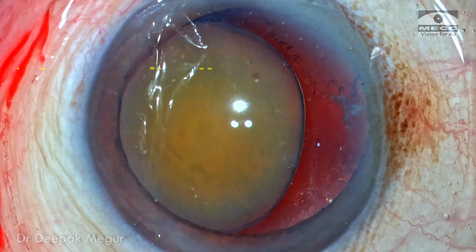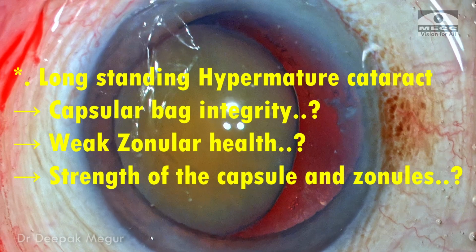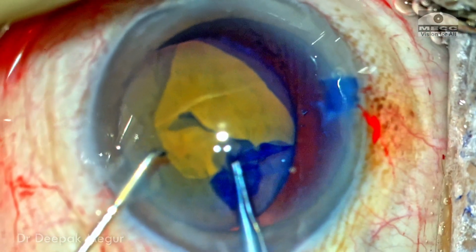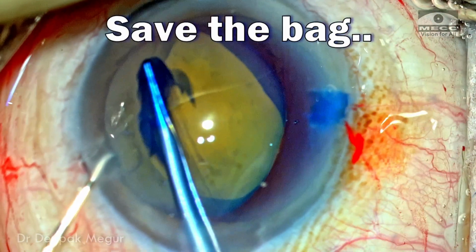So to summarize, this was a challenging case. There were multiple issues to deal with. Primarily the health of the anterior capsule and the capsular zonular apparatus. And we need to have a backup plan as well. In the worst case scenario, if the bag was lost, I was ready with an iris clip lens as well. But thankfully, the bag could be saved.